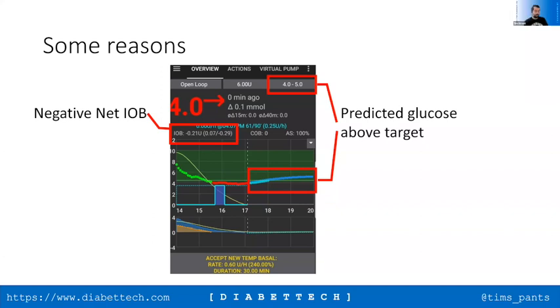Historically, as users of various systems, we've been encouraged to set ranges within which we want to operate on a day-to-day basis. So historically, a range was the range of glucose levels within which you wanted to be when you were using, for example, the bolus calculator on a pump. So that the pump would then, when you entered your carbs, give you an insulin amount to get you into that range, and would then give the pump a bit of a space so that you ideally wouldn't go too low.